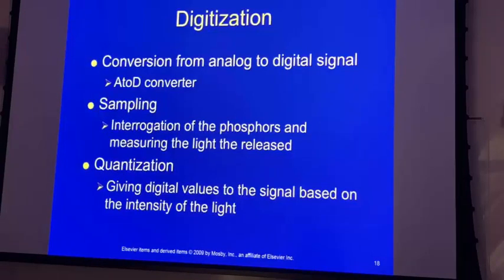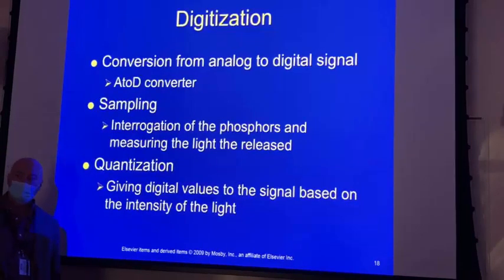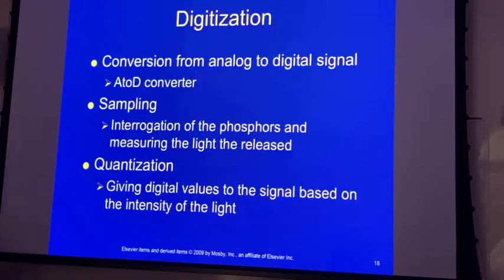So again, back to the analogy of the comparison between the soft tissue, the lung tissue, and the ribs. Maybe it gives a value of 50 for the lung tissue and a value of 20 for the ribs based on the glow that comes off of that. Those are just numbers I'm pulling out of the air.